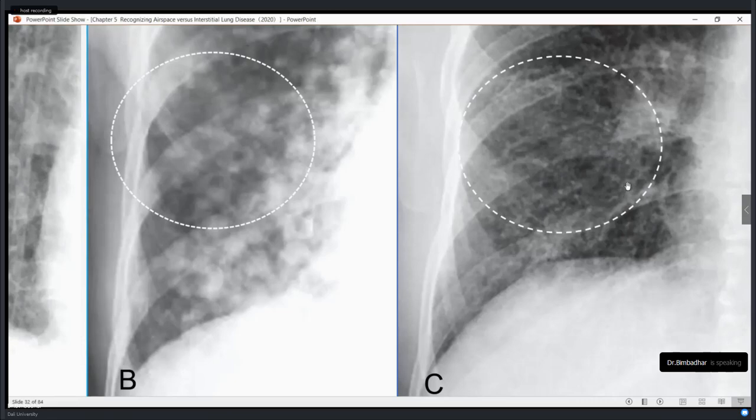You see here, this is the bronchus. But close to it, you see the smaller dots. Let us say this one, the bronchus is almost visible here. This one is actually going down as a vertical bronchus, right? That is passing down in the lower lobes, going horizontally from the posterior side and projecting down to the anterior side, right?